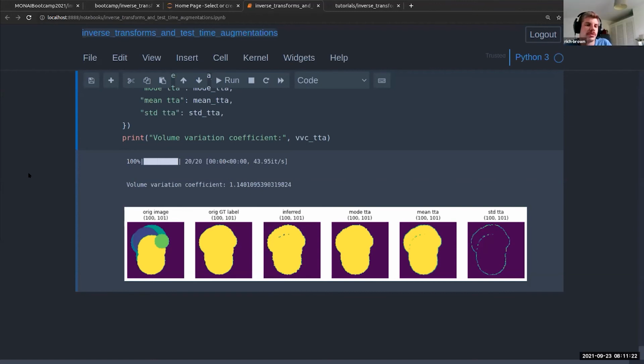I think you would want to put your random transformations in if you were going to do something like test time augmentation. You're right, when you come to using your test data, hopefully you're at the point where you want to deploy your model. Normally for our test transformations and our validation transformations, we don't really put any of those random data augmentations. It's only really in the training that we would do that. But you still may want to do the inverse of that.